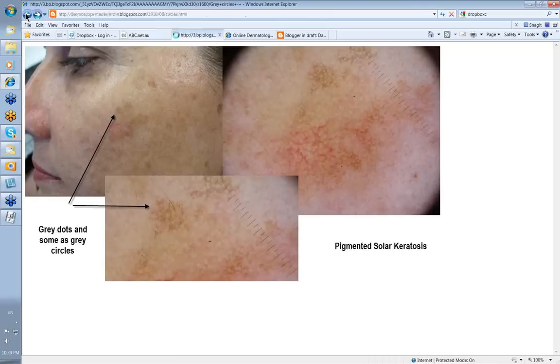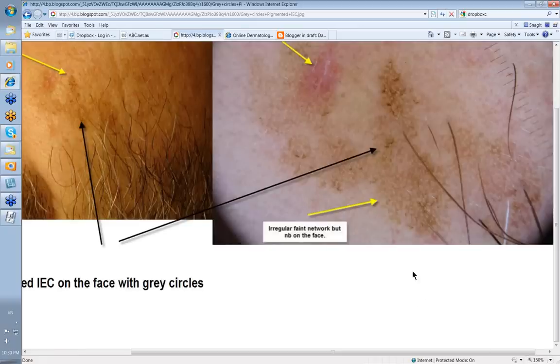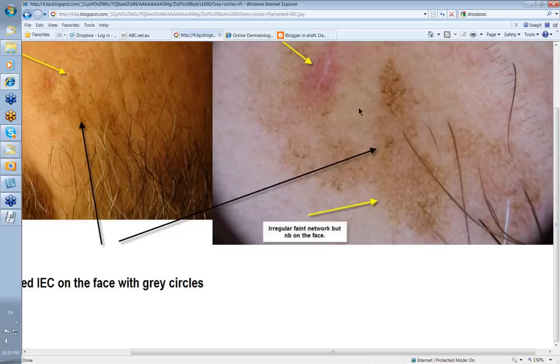This was a diffuse pigmented area on the face. I thought this one was going to be a pigmented solar keratosis, but looking more carefully, you can see some grey circles — you might say it's a hemi-circle, only half a circle that you're in fact seeing. But if you look a little bit more carefully, there are some grey circles here as well. On histology, this showed full-thickness keratinocyte atypia and was classified as a pigmented IEC — pigmented intraepidermal carcinoma. Generally these will have grey dots, quite a few of them, and sometimes dots as lines.